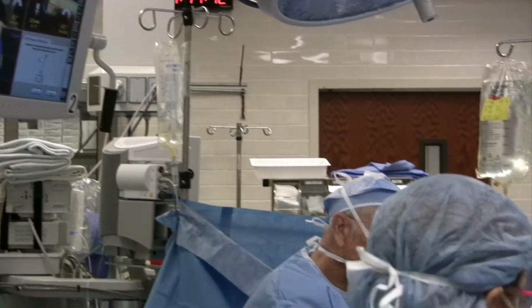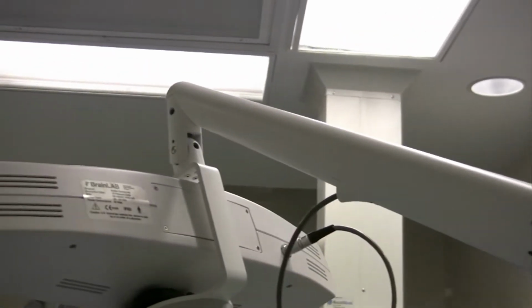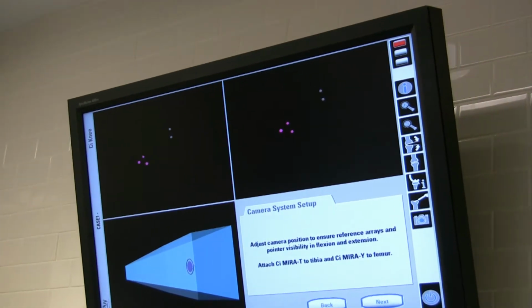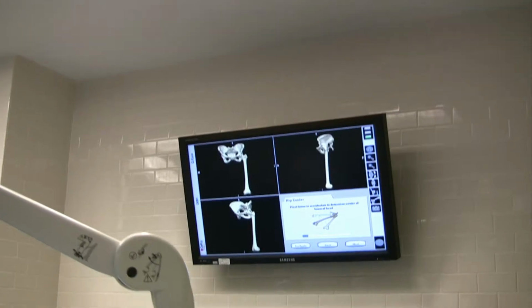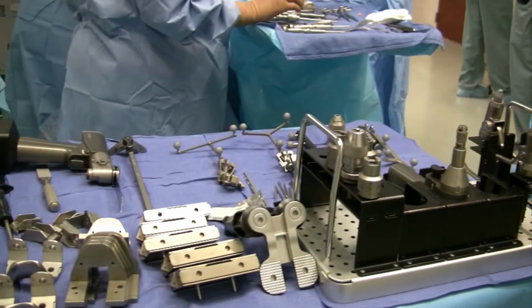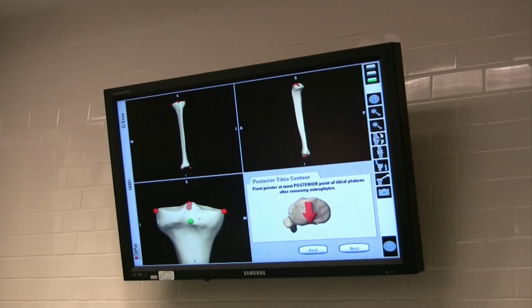Now what does a computer do? We don't put any rods up into the thigh bone or into the shin bone. Basically what we do with the computer is we put these computer arrays on the knee, and then we trace out the knee. And when we trace out the knee, the computer creates a model of the knee. So then you have a model of the knee on the computer, and before you start cutting it on the patient, we can do all the cuts, we can do all the planning on the computer. We change it to the levels of resection, and then say, okay, that's what we want. And then the computer's still looking at the knee.